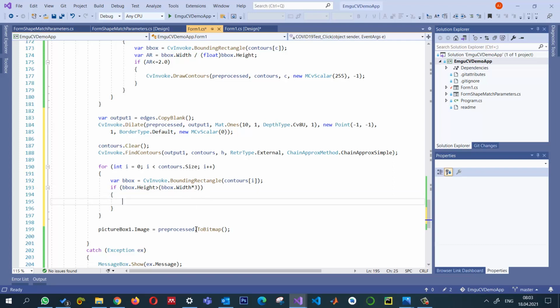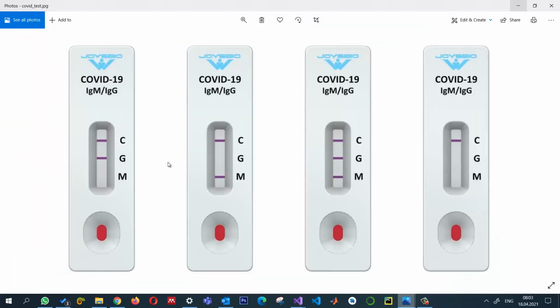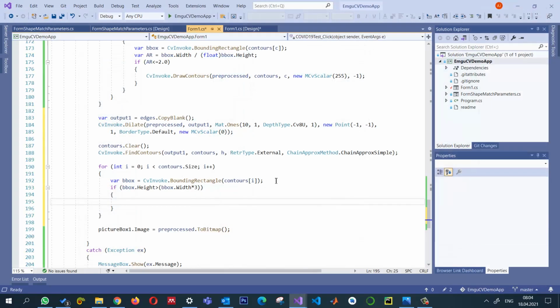Okay, then we want to count how many contours are there inside it. So once we say that this is one of the contours, I want to see, if I find that this is the only contour that we have, then we have to count how many contours are here. For example, here if you see, this will be one contour, this will be another, this one will be another. So this is a negative one. So here you can also see there will be 2 blocks only. So this is negative. There will be 1, 2, 3, 4 parts, and only in this case it is considered to be positive. So again, what I will do, actually we had 2 images.